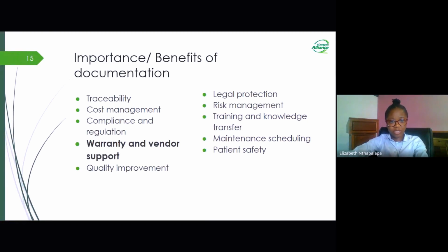Another importance that we get from the documentation is warranty and vendor support. Maintaining accurate records is essential for warranty claims because there are other equipments that the vendors are the ones who need to be maintaining them and following up with the claims. So if we have those documents ready with us, we are free as a facility to claim those warranties and to make sure that our equipments are properly handled and maintained.